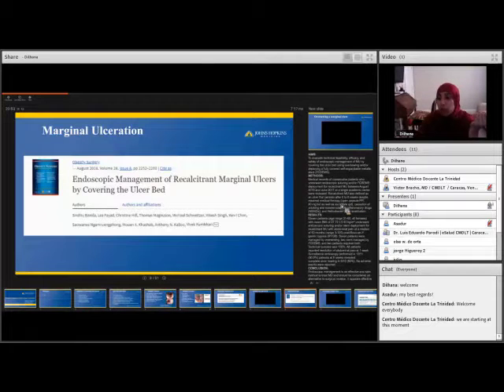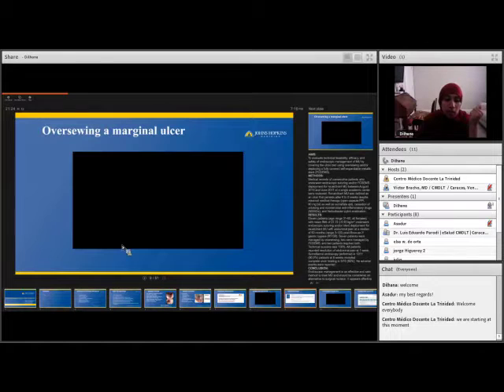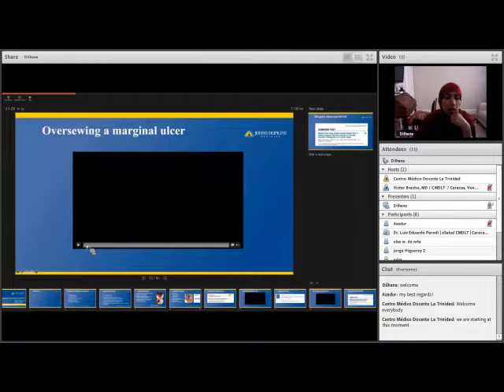Now, this is another video I'm going to show you, and this was a study again from our institute for the endoscopic management of recalcitrant marginal ulcers. And we actually had several patients present in this fashion. The way we defined a recalcitrant marginal ulcer was that it was an ulcer that persisted for up to 6 to 8 weeks despite maximal medical therapy. And when we say maximal medical therapy, we're talking about 40 milligrams of a PPI twice a day, as well as sucralfate 4 times a day.